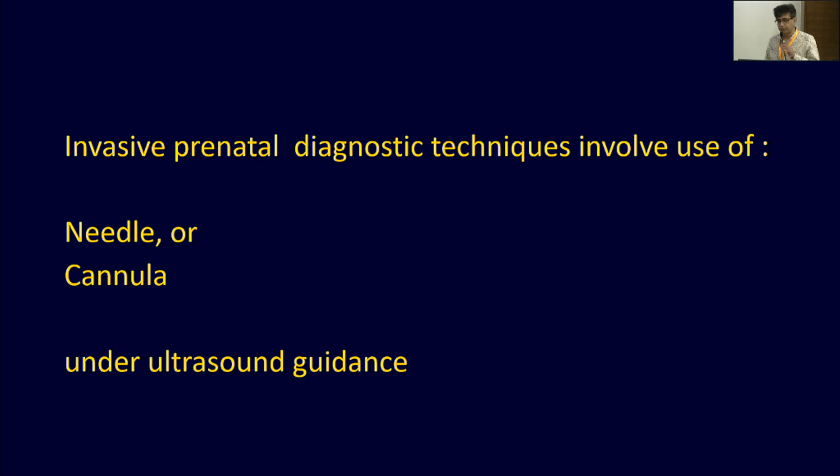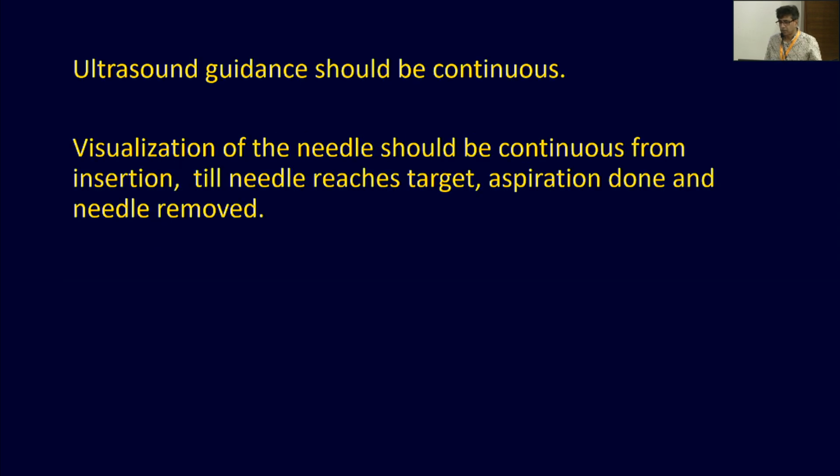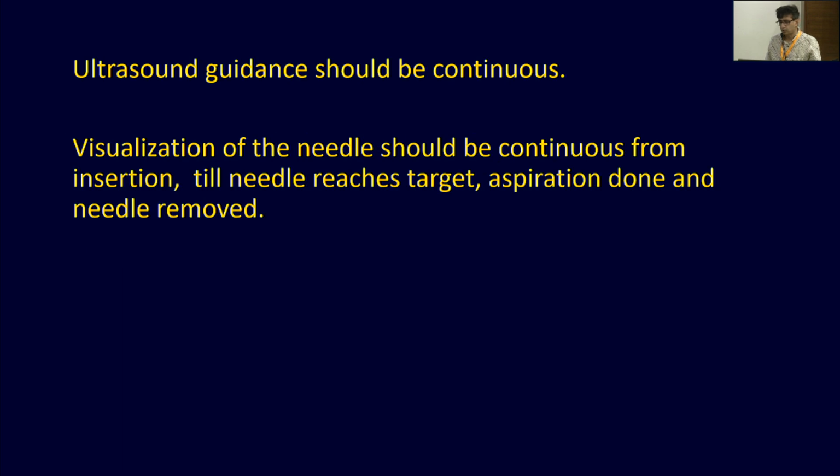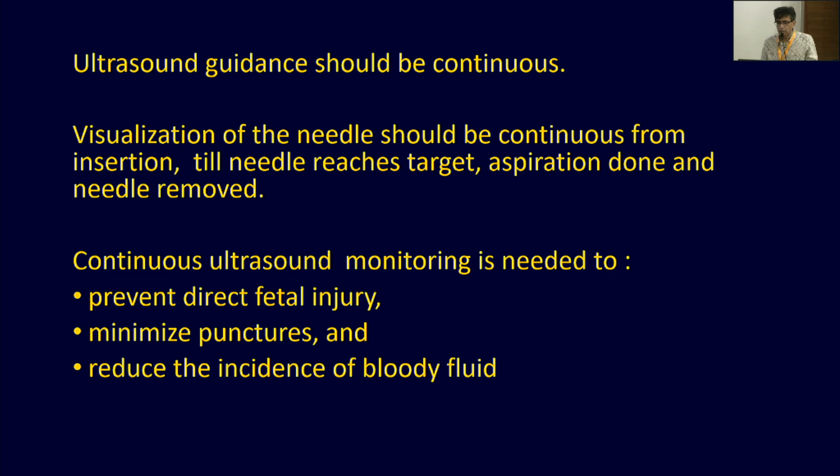And when we want to do prenatal genetic testing, we have to carry out an invasive prenatal diagnostic technique, and that involves use of either a needle or a cannula under ultrasound guidance. Whenever you are putting a needle or cannula, the ultrasound guidance should be continuous. This means the needle should be visualized continuously from the insertion till it reaches the target, aspiration is done, and the needle is removed. Now, why is that required? To prevent any fetal injury, to minimize multiple punctures, or to reduce the incidence of bloody fluid.